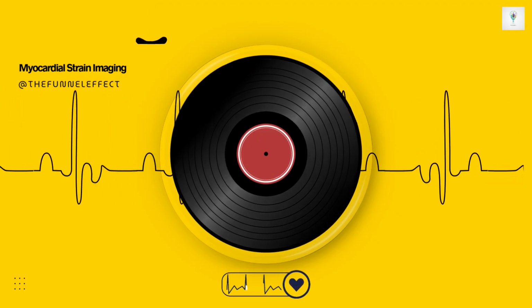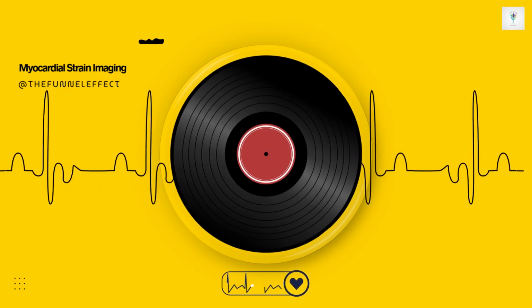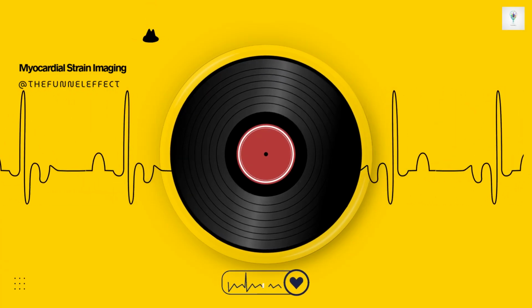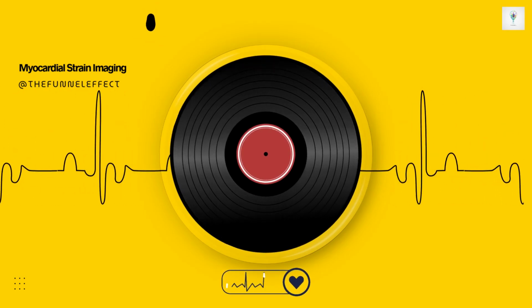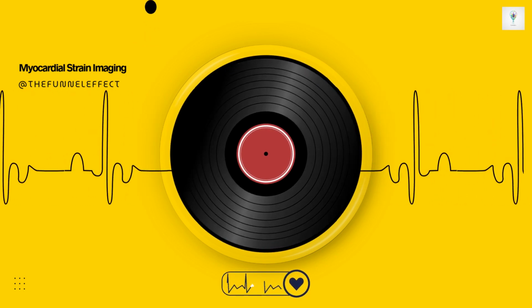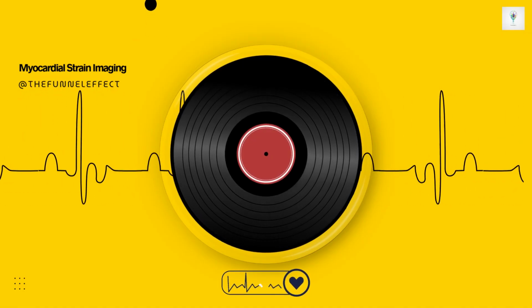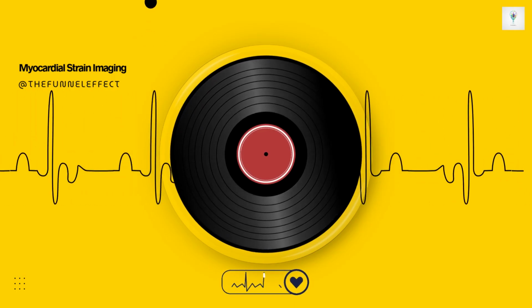And LA function is tightly linked to the LV. Very tightly. LA function, particularly its stiffness and ability to relax, is closely related to the pressure and stiffness of the left ventricle it's trying to fill. So LA strain gives us a window into LV diastolic health. Which of those three LA functions, reservoir, conduit, pump, provides the most reliable strain measurement? The LA reservoir strain is generally considered the most robust and prognostically valuable parameter. This measures the maximum extent the LA stretches as it fills with blood during LV systole.